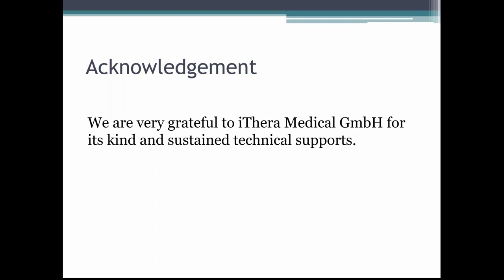The second question is, does your ALP probe also pick up bone ALP signal? Well, this is a very good question. Actually, the probe can respond to ALP from anywhere. But in our work, our probe actually reached the liver region and responded to the hepatic ALP level in situ. So we actually collect the signals from the liver region in real time. Okay, thank you for the answer.